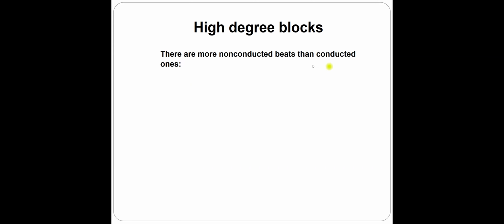Okay, thank you. Now, let's see the third degree blocks. That's a simple one because there is no connection between these 2 points, forever. And the escape rhythm is going to save the life of the patient. So if you want to say there is no connection between A and B, that's it.